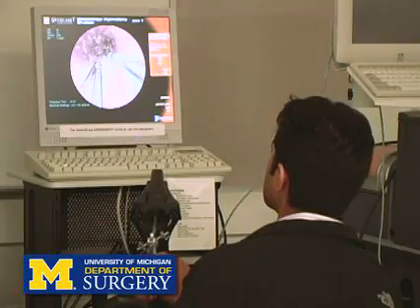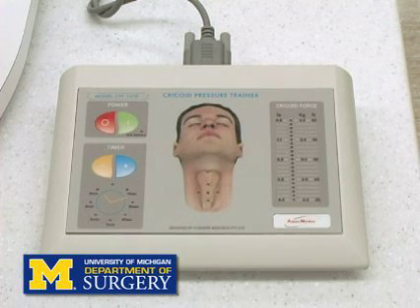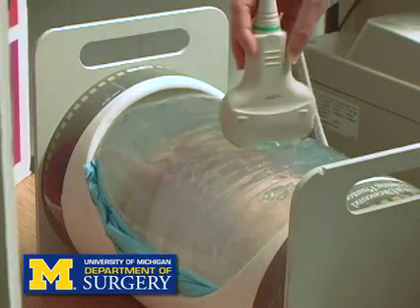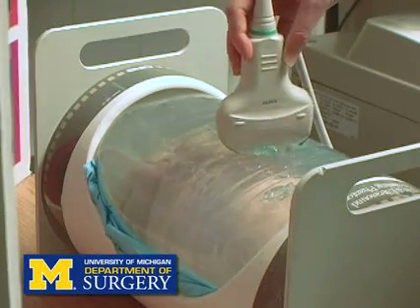And we also have the capability for a large amount of low fidelity simulation, or what you think of as benchtop simulation, either using tissue models or other non-tissue based simple models for procedures like chest tube placement, cricothyroidotomy. I tell people a lot of times that an hour of your time down here is equal to 3 hours of time in the classroom with an instructor, because you really get true hands-on learning. And so it involves everything: the cognitive, the psychomotor, the critical thinking skills. All of those things play into this kind of simulation down here.